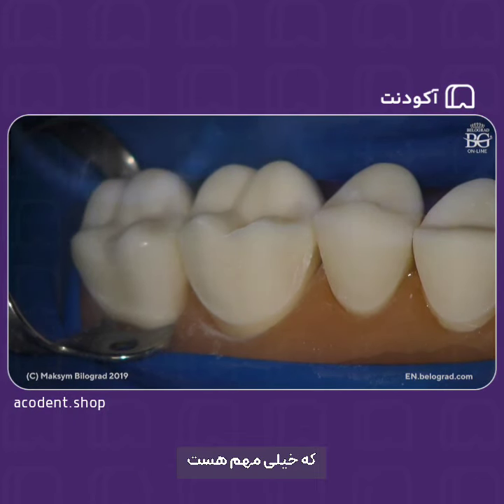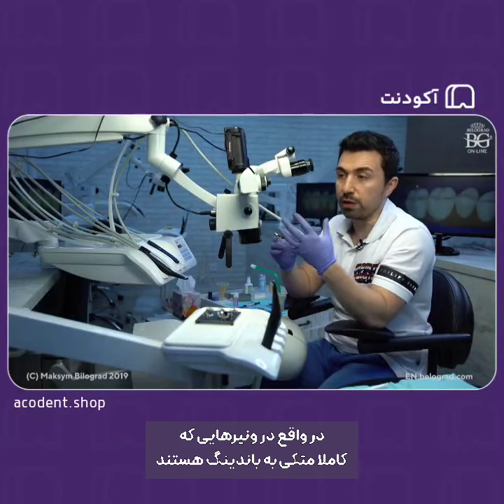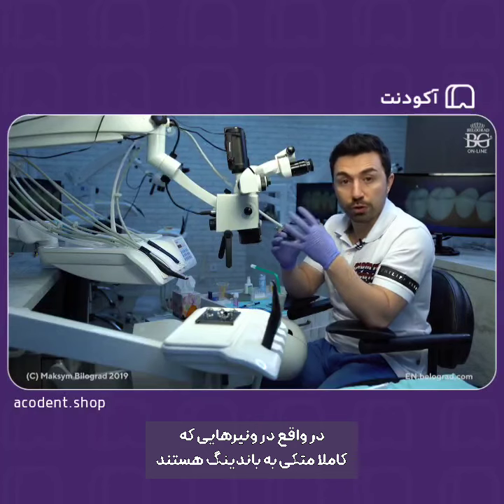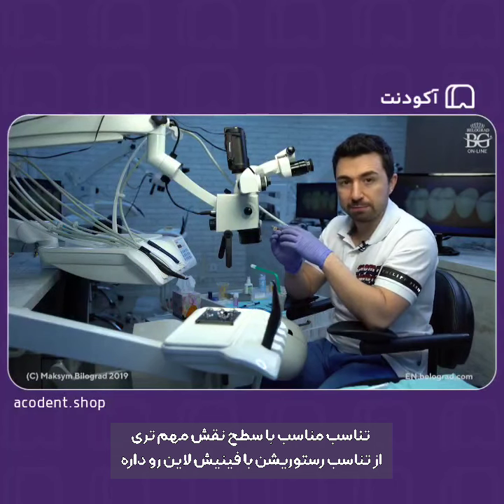And when you have smooth internal surface, you may get a really good surface fit of ceramic restoration, which is really, really important, because in the thin ceramic restorations, in veneers that are completely reliant on bonding, the surface fit plays more important role than fit to finish line.